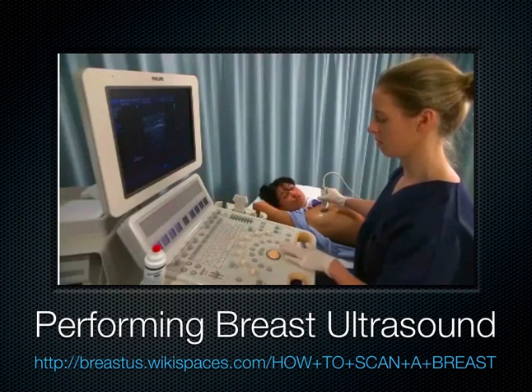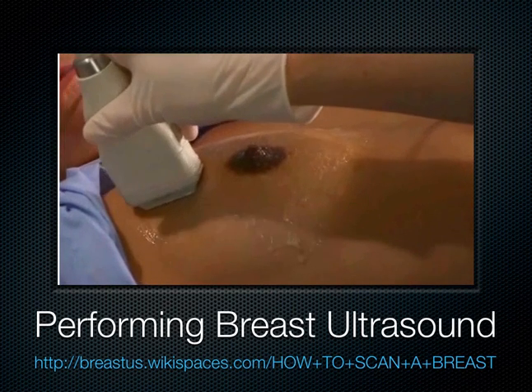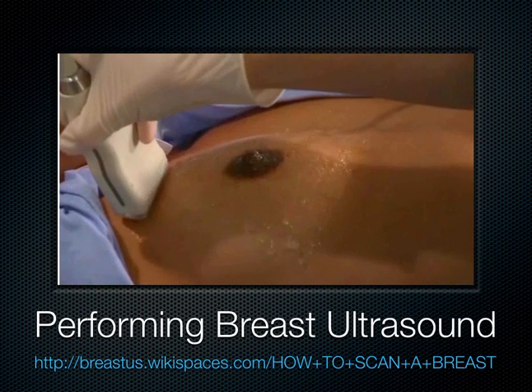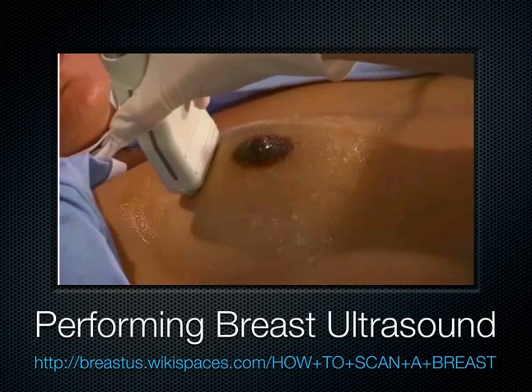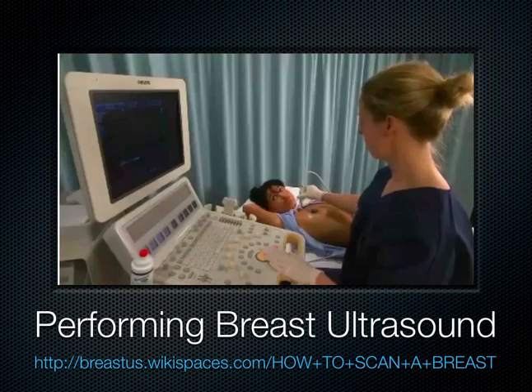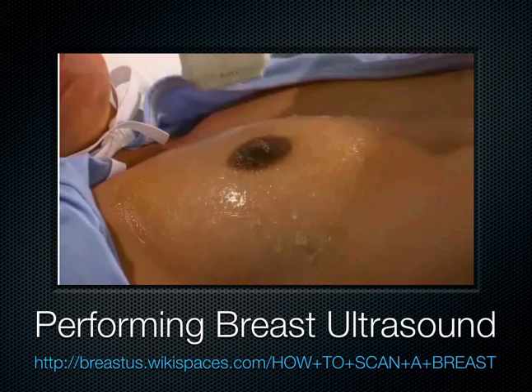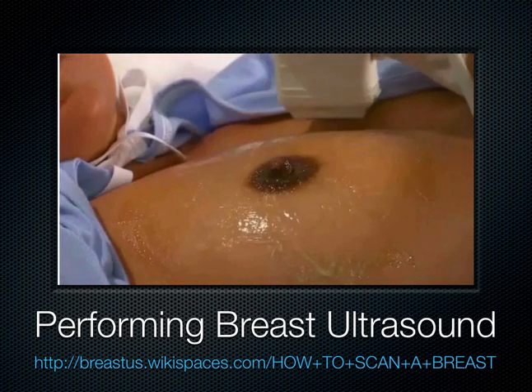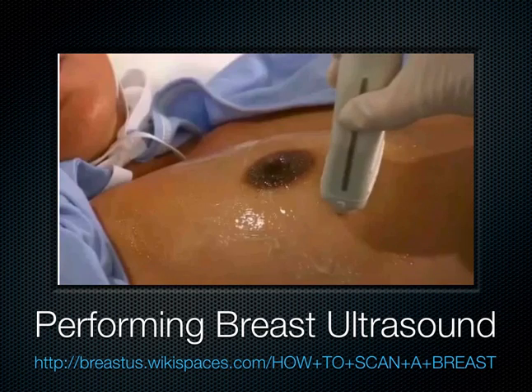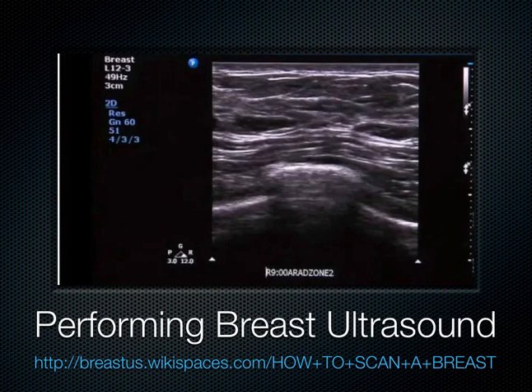After completing the radial scan, return the transducer to the 12 o'clock position at the outer margin of the breast. Rotate the transducer to the anti-radial plane. Slide the transducer from the outer margin of the breast towards the nipple. Repeat this at each of the clock positions, moving in a clockwise direction. At the clock face positions 12, 3, 6, and 9, freeze, annotate, and save a suitable image from the mid-portion of the breast.